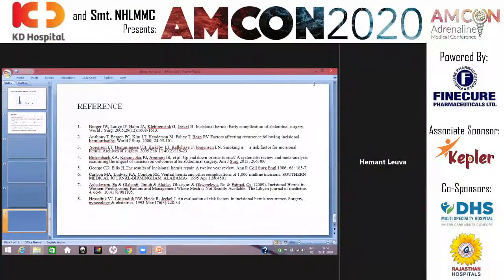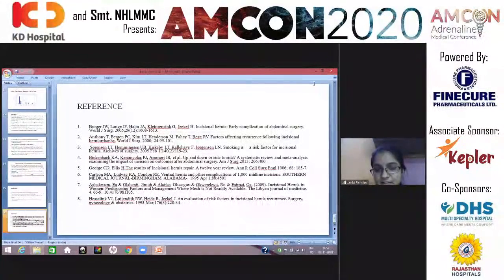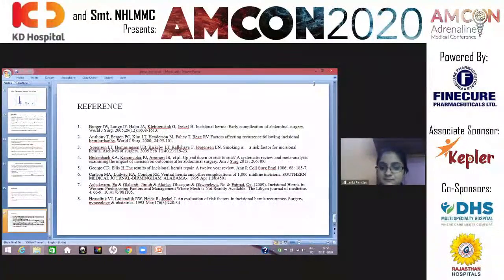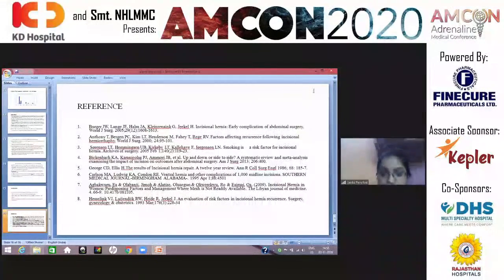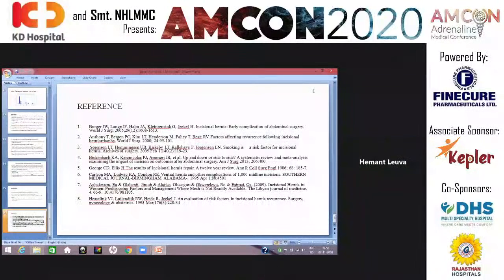What was your experience with the different kinds of meshes? Sir, in this study, a soft polypropylene mesh was used in all 50 cases. So, sir, that was not studied. What are the characteristics of this mesh? It is a soft mesh made up of polypropylene, that is Prolene. Okay, thank you.